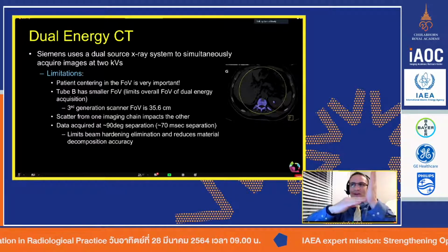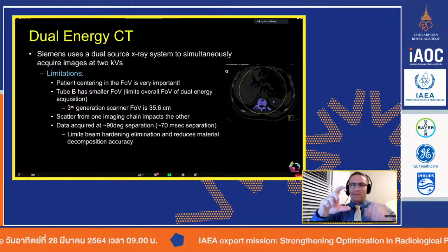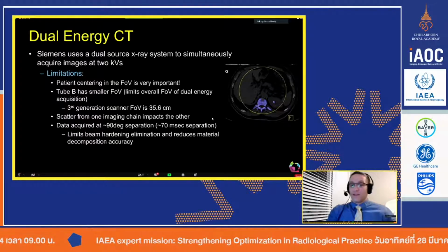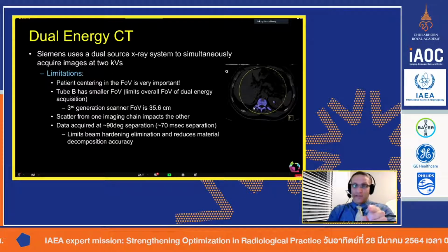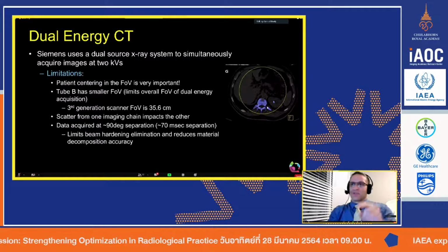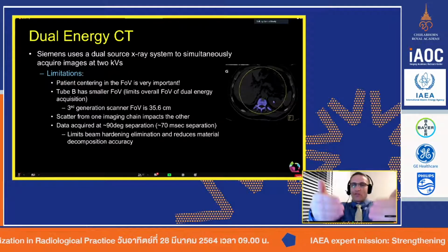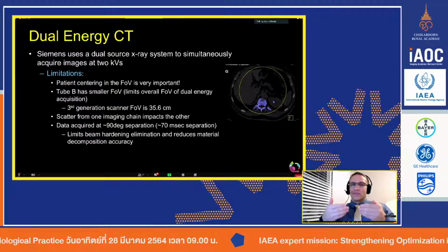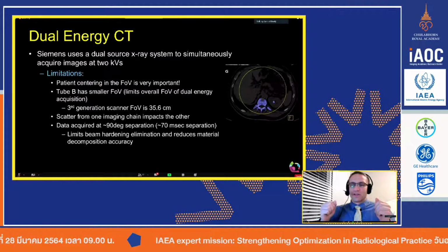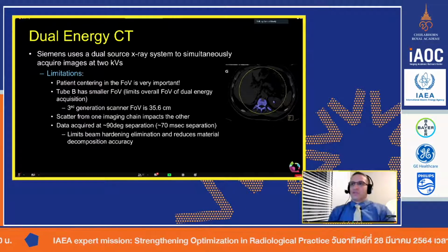They're actually 95 degrees. They kind of opened it up just a little bit so they could make the second tube detector a little longer. But yeah, if this is the scanner you have and you need to see dual energy somewhere outside of that circle, when you put the patient on the table and create the localizer image, you're looking at their topogram or their scout image. It will tell you where on that image you will see dual energy.